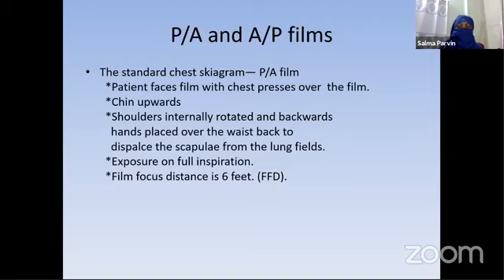So the important point is, whenever you have a film exposed in AP position, the patients are really much ill and to be concerned with acute conditions, that at that time the patient cannot stand up or doesn't have the ability even to be seated.